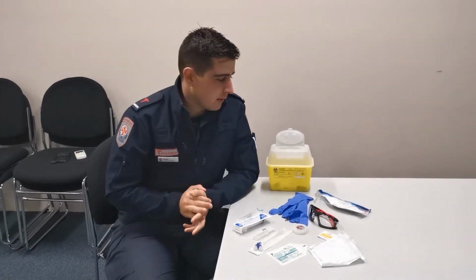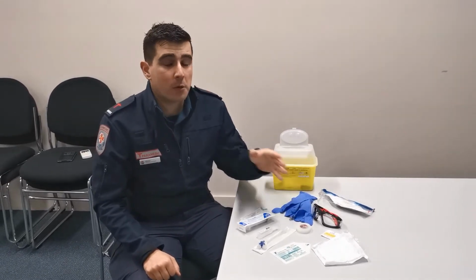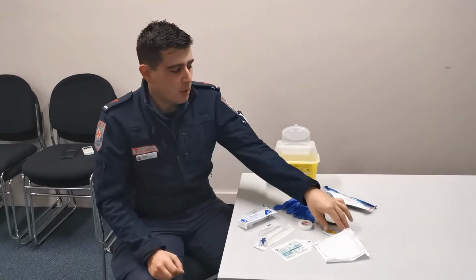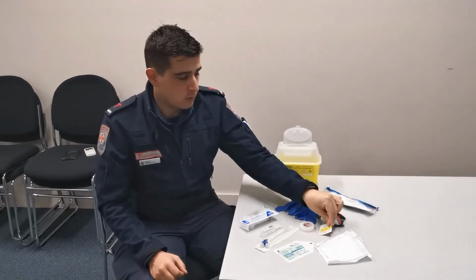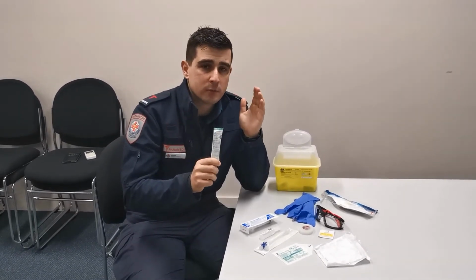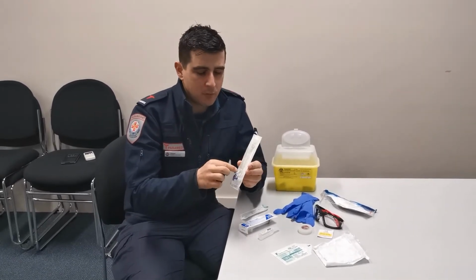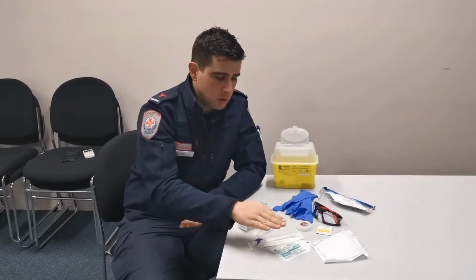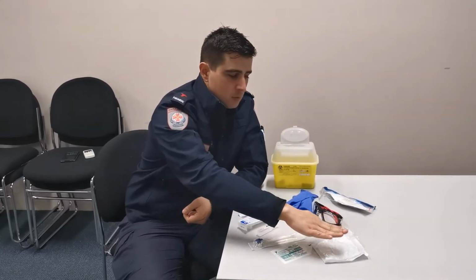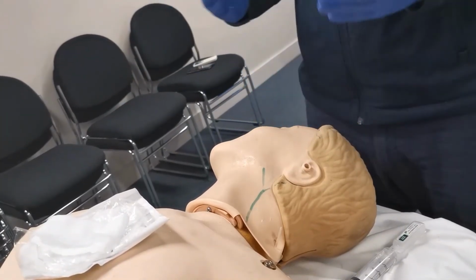So for the procedure in external jugular, the equipment you require is your standard precautions: gloves, goggles and mask. For this video, I actually won't be using a mask just due to the sound quality. Follow your local state's guidelines in regards to your antimicrobial wipes. The appropriate size cannula, I like a 16 gauge, it gives a good balance between flow rate and extravasation not occurring. A 3-way tap with a J-loop extension, a large 20mL flush, aseptic Tegaderm, tape, gauze. These procedures are notoriously hard to occlude, so therefore they can bleed, and a sharps container to dispose of your needles.